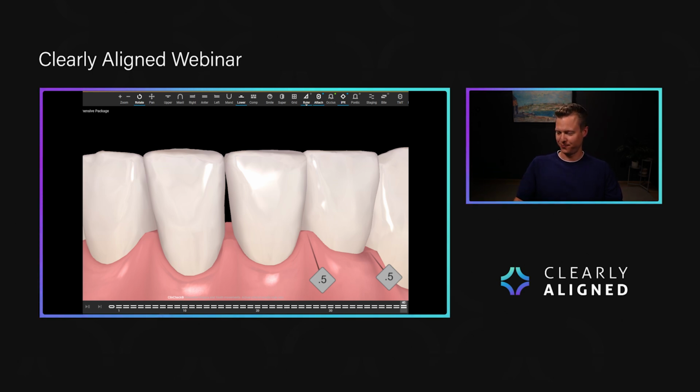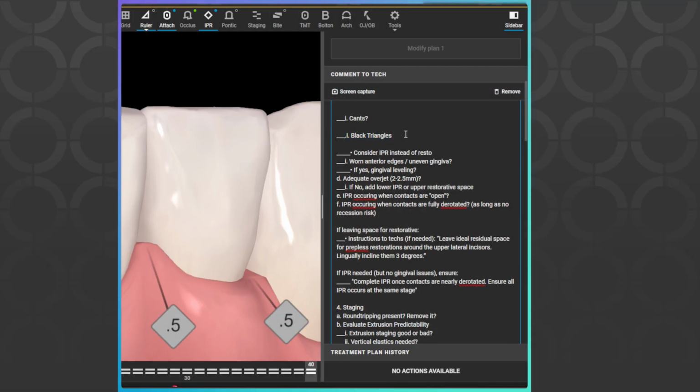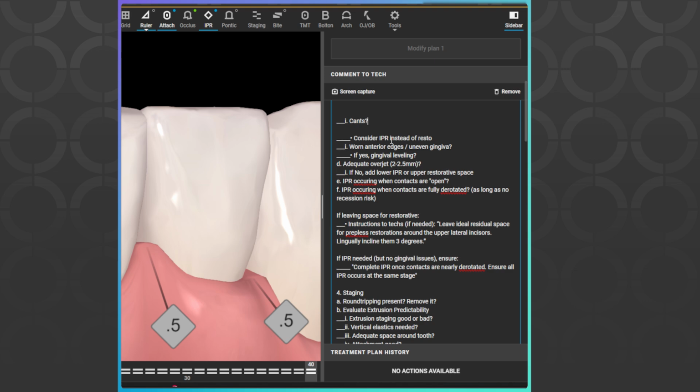Okay, so black triangles. Do we have them? Yes. Are we going to do anything about them right now? Probably not. But you could go ahead and put some IPR in those areas if you wanted to.